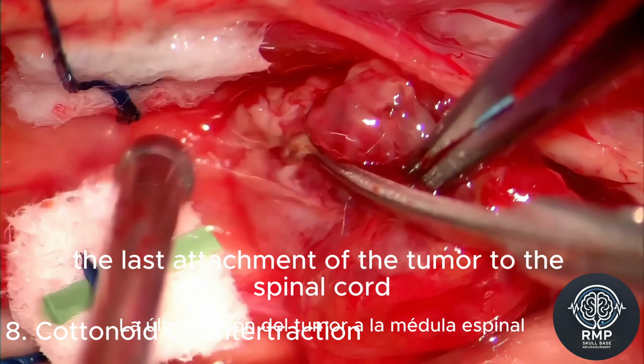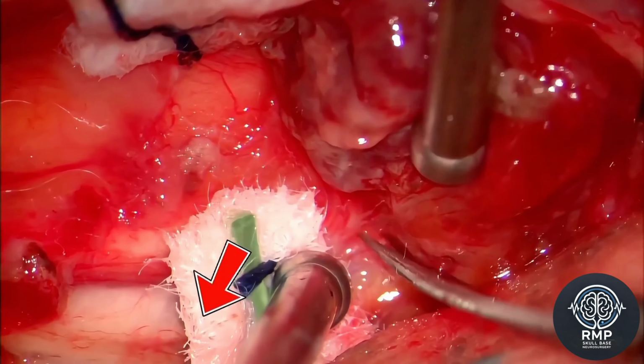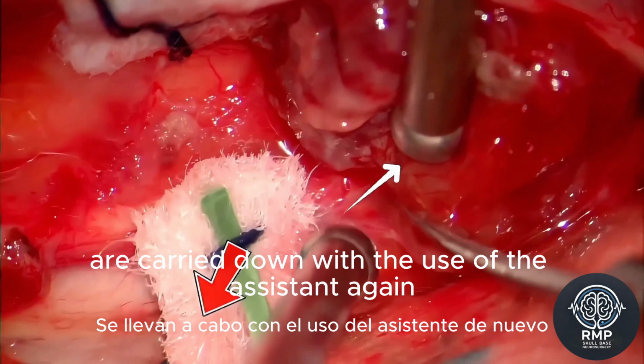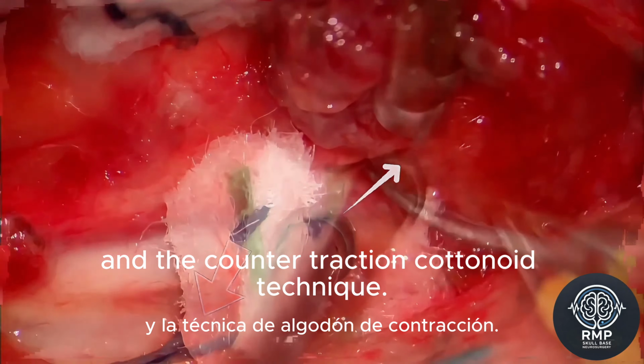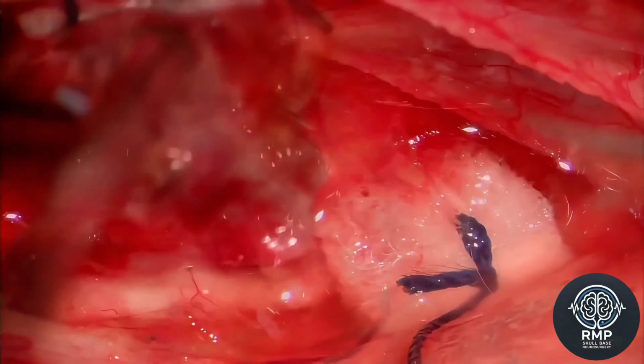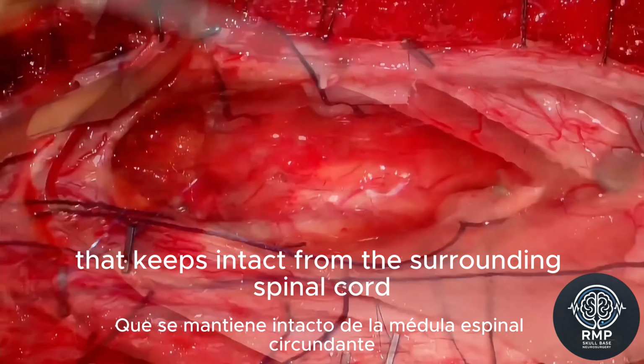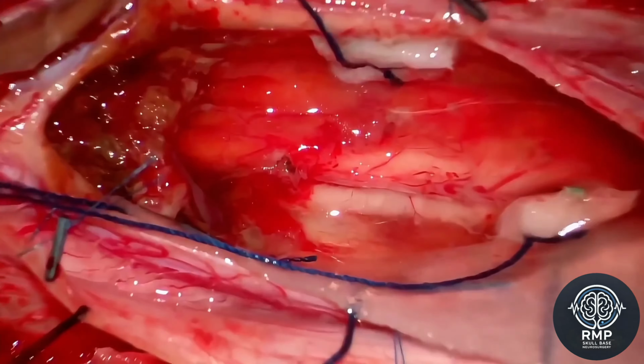Finally, the last attachments of the tumor to the spinal cord are taken down with the assistant again and the countertraction cottonoid technique. See how the blood loss is minimal, as the tumor creates this film around its capsule that keeps it separate from the surrounding spinal cord.